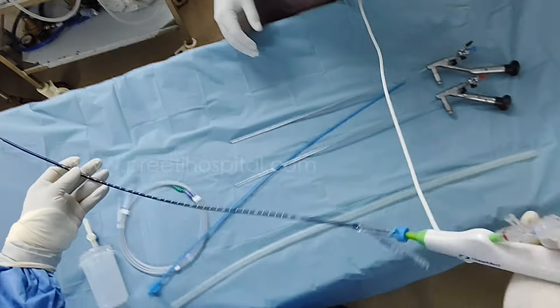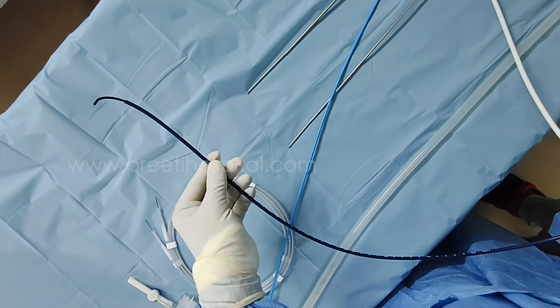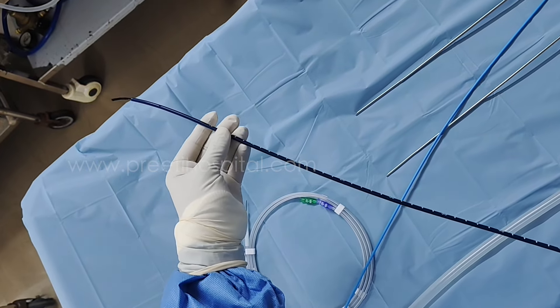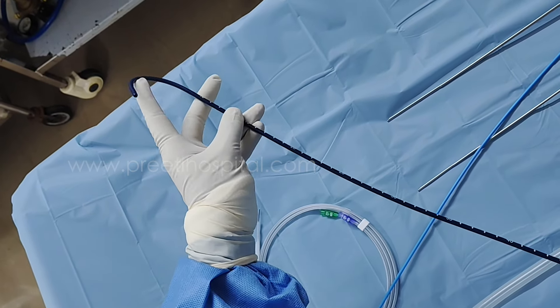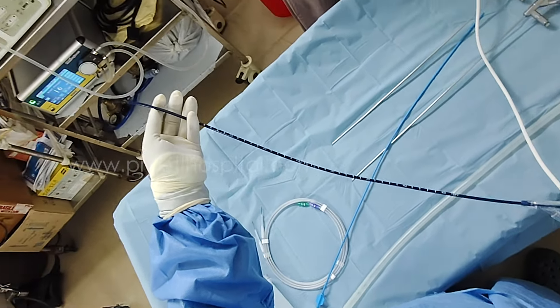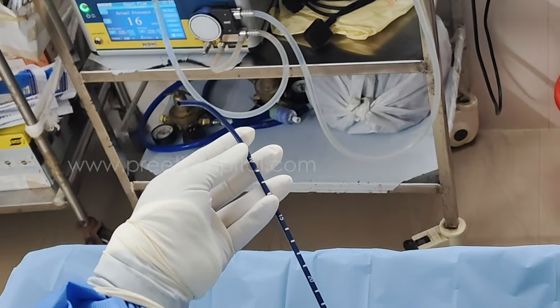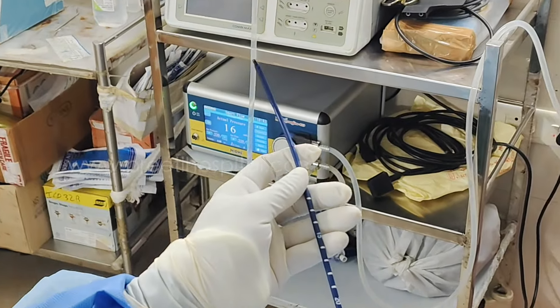There are various types of bending. One problem is when the scope is completely outside and it is forcibly flexing — the scope can break because the scope angle is bending against resistance. That's why if you want to do it, you should align the sheath angle with the scope angle so they correlate. If you put it straight and only the angle is bending, it will get resistance and break. The correct technique is to keep the scope slightly inside and then bend.